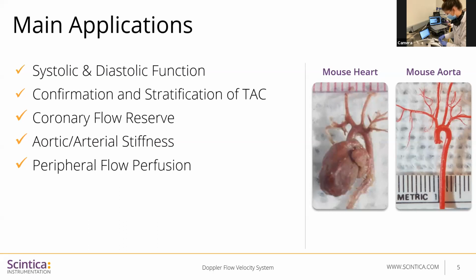She's taped the paws down to the ECG leads, and that provides us with the ECG signal into the Doppler flow system. She's using a rectal probe to monitor the temperature so that we know how the animal is doing, and the respiratory signal is also visible. Okay, so at this point, I'm going to have Sydney share the screen with the software from the Doppler flow system.